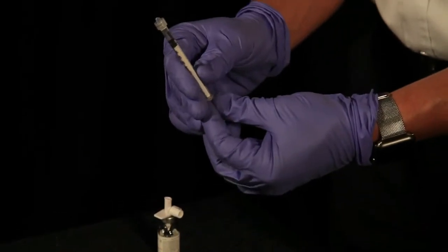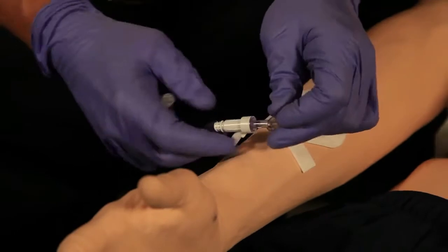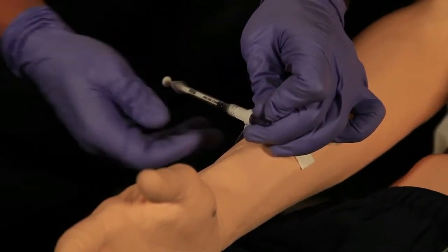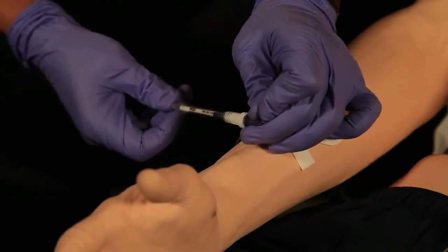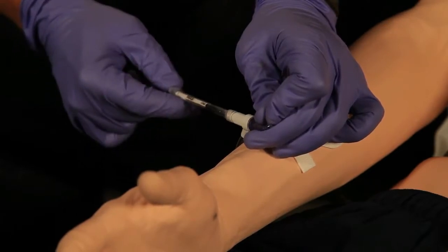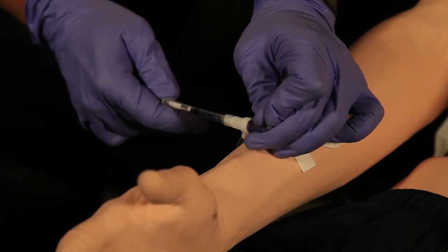Make sure we get the air out of there. We're going to go ahead once again and pinch it off to the patient. We're going to draw up the remainder dead space of the actual 1 cc syringe with normal saline. So again, we'll have 1 mL that contains 25 milligrams of ketamine.